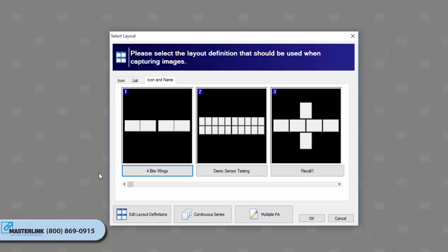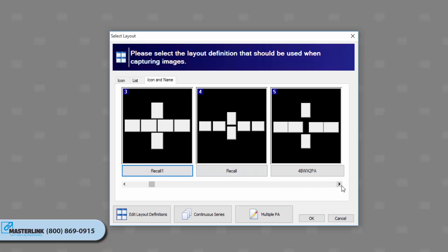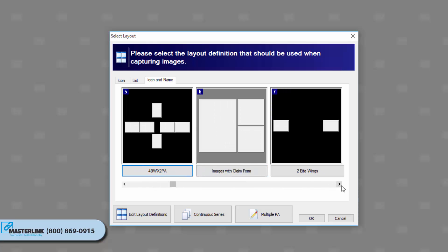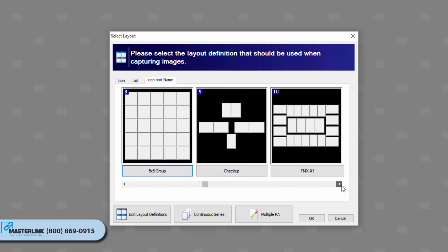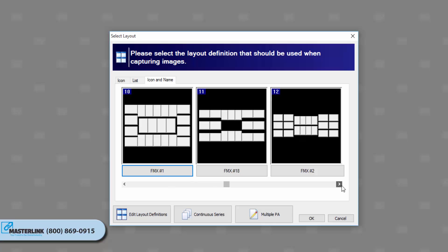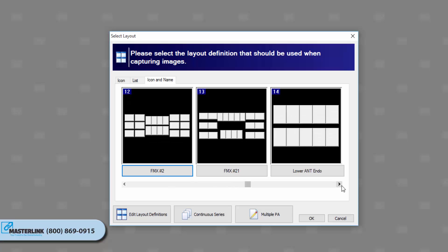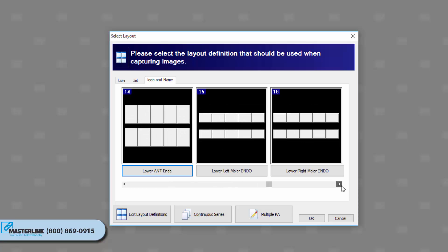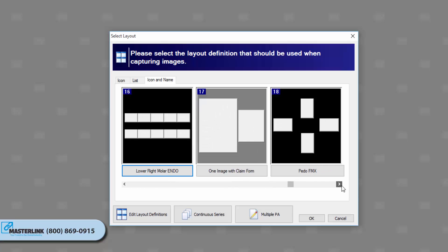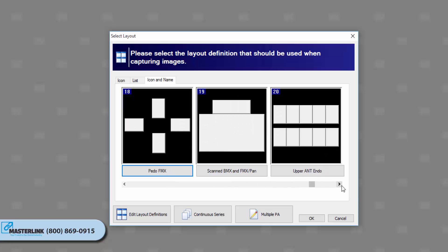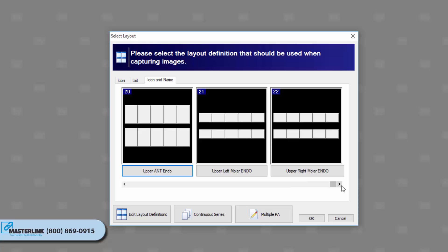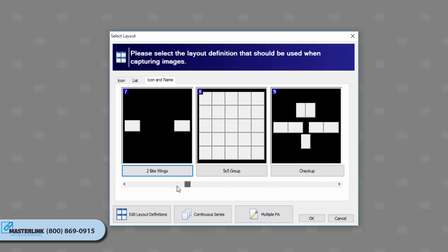By default, X-Ray Vision includes layouts for bite wings, posteriors, anteriors, full mouth series, etc. Layouts can be edited or created in the Layout Definition options. More information on creating layouts and editing layouts will be covered in a later video.